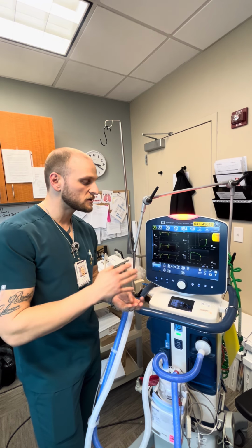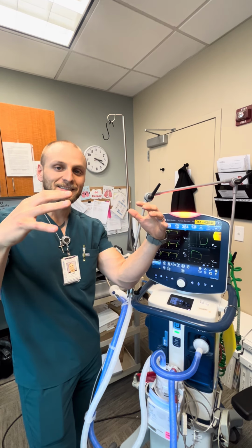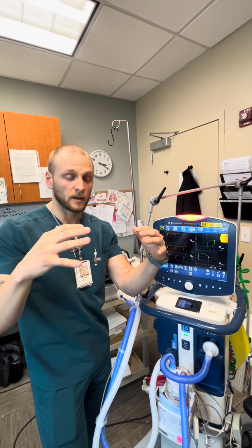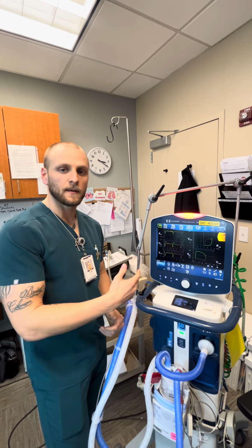The longer these patients are on, theoretically, the more time you keep them at that high safe pressure, the more time you give those lungs to improve. Oxygenation will improve and lung compliance will improve, okay? How do we wean now? We're going to go to that, all right?